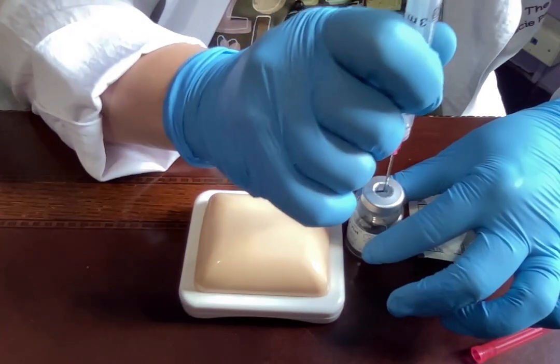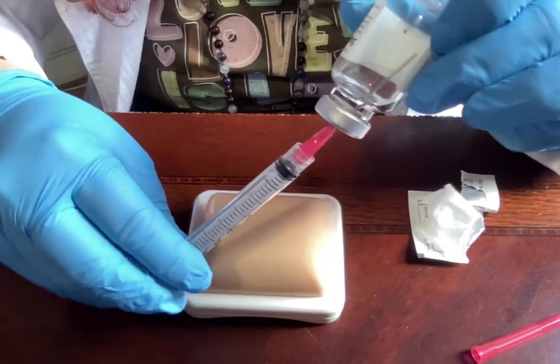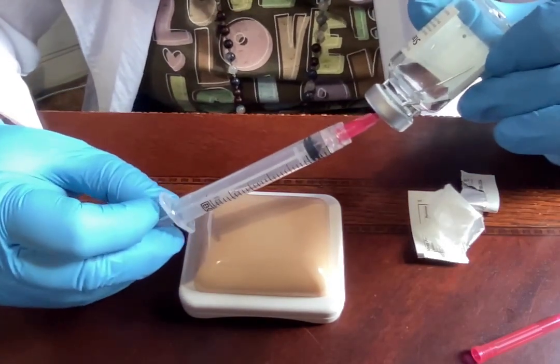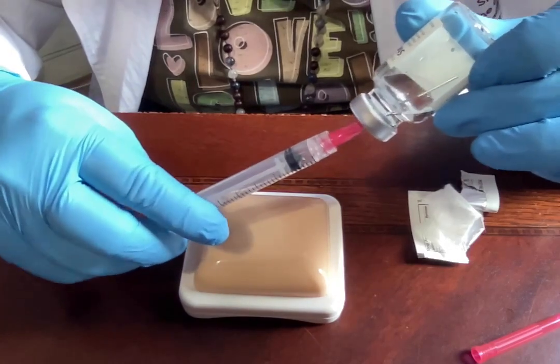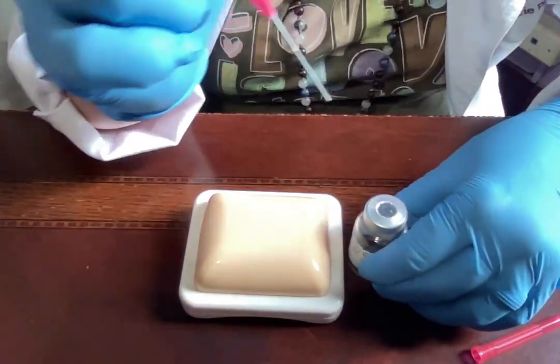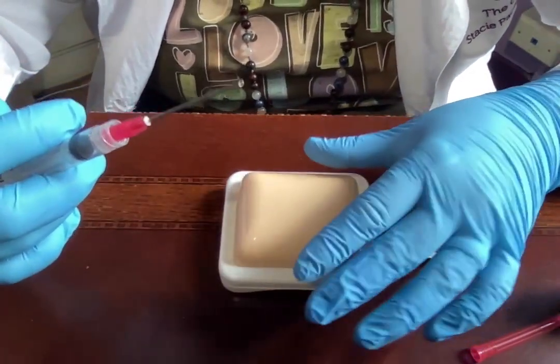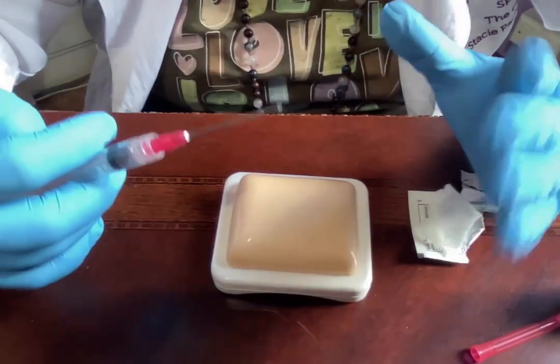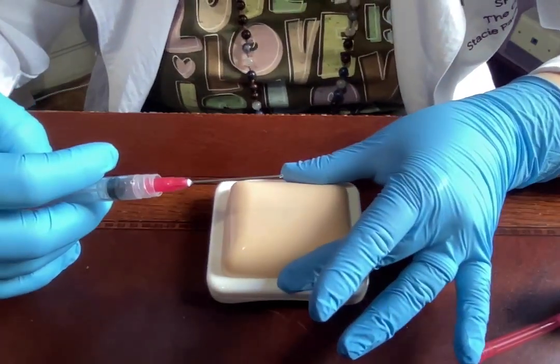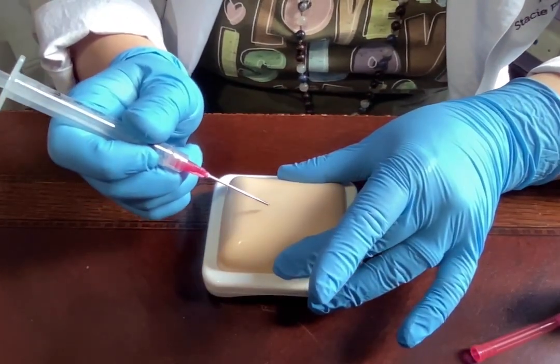First, cleanse your injection site with the alcohol pad — 10 seconds, circular motion. Same for your medication vial — scrub the hub for 10 seconds circular motion. No bacteria getting in there. Set the pad aside. Pull up 0.5 mL of air, remove the cap, hold on a firm surface, insert through the stopper, flip upside down, inject the air, confirm the tip is below the liquid, then draw out 0.5 mL. Air bubbles are fine, they won't hurt you.